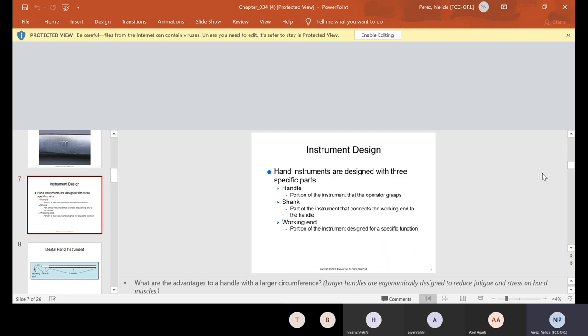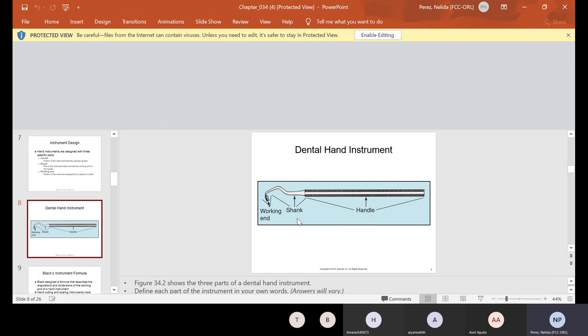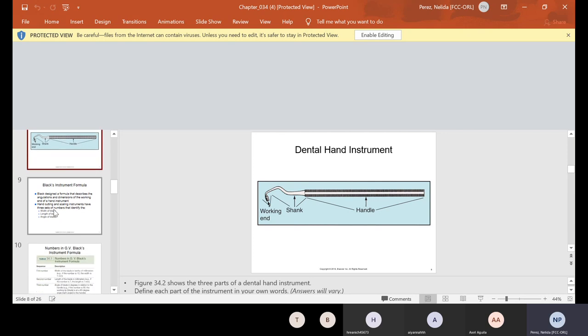Instrument design. Hand instruments are designed with three specific parts. You have the handle, which is the portion of the instrument that the operator grasps. You have the shank, which is the part of the instrument that connects the working end to the handle. And you have the working end, which is the portion of the instrument designed for a specific function. This is the handle, of course, that the doctor will grasp. The shank is in the middle here. And then the working end is the part that the doctor will use to work with.